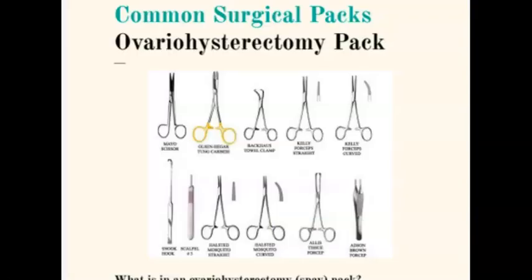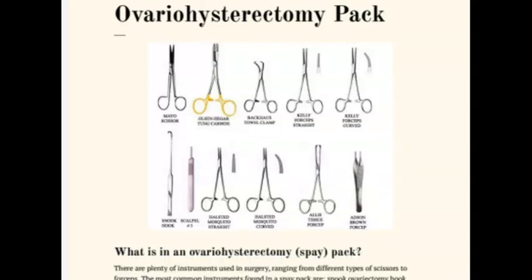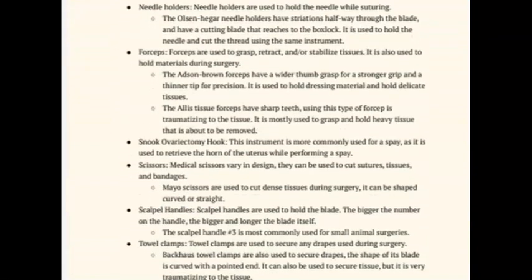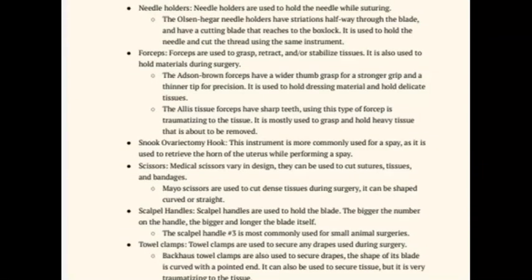This next example represents the common surgical instruments for an ovariohysterectomy. So there's visual representation of the instruments used in a spay pack, as well as a brief explanation of those instruments. So something like this would be very suitable for your assignment.